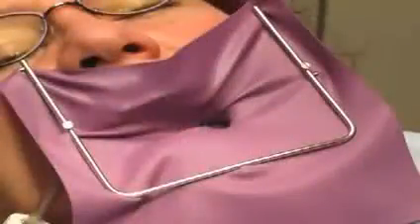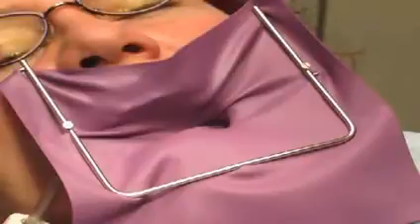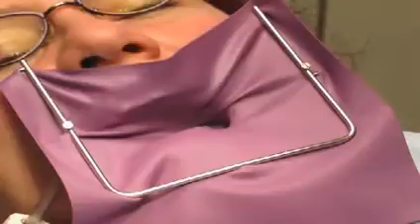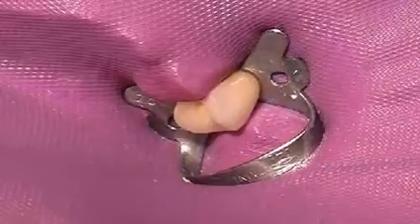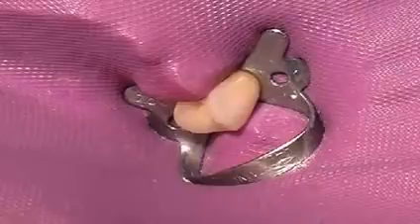In order to facilitate this in the mouth, it's imperative that the dentist works with a cofferdam, because this is the only way to prevent saliva from reaching the interior of the tooth. More on that in the video entitled Cofferdam. Saliva contains many different bacteria that can endanger the success of a root canal treatment. Here you see a cofferdam insulating the tooth from the tongue, other teeth, saliva, and blood.